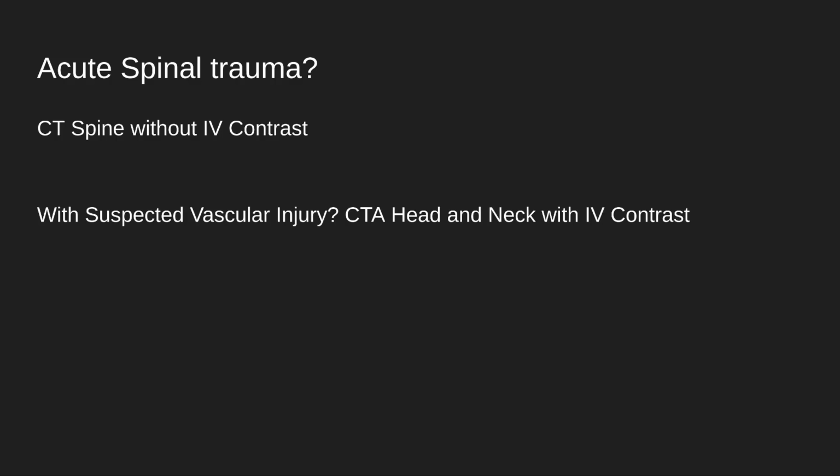However, if a patient comes to you with lower back pain, for example, and it's suspected to be sciatica or is in a non-trauma setting, in this case, CT spine will never ever solve the issue. CT spine will assess the bone, but it will never assess the soft tissue like the discs or if you suspect discitis. So this is quite important to know because there are people from rehab, from orthopedics, who assume that for any back pain you must do CT spine, which is not true. So any case of trauma, CT spine without IV contrast.